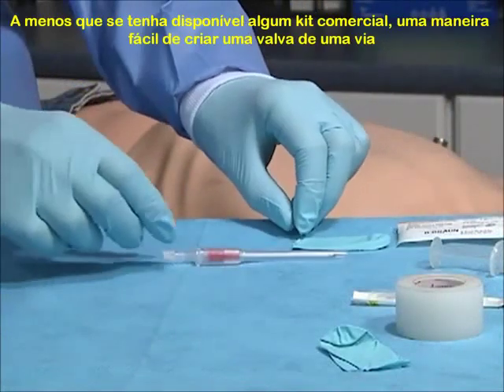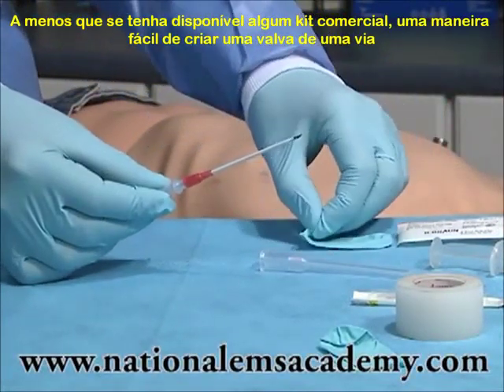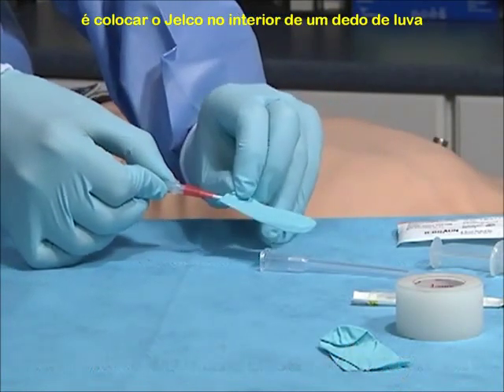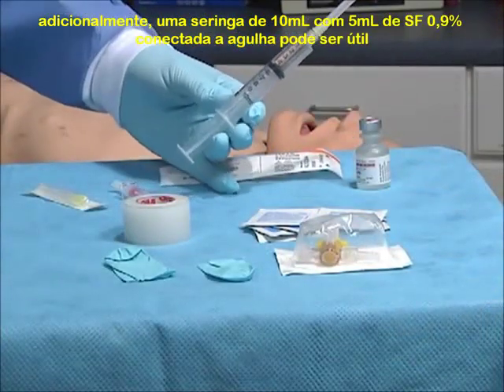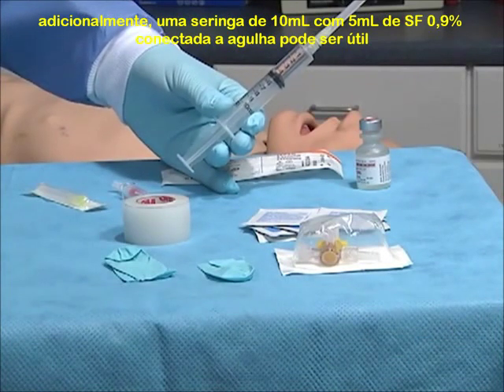Unless you have access to commercial decompression supplies, the simplest way to construct a one-way valve is to insert the IV catheter into the finger of a glove. Additionally, a 10-milliliter syringe filled with 5 milliliters of normal saline attached to the needle may be helpful.